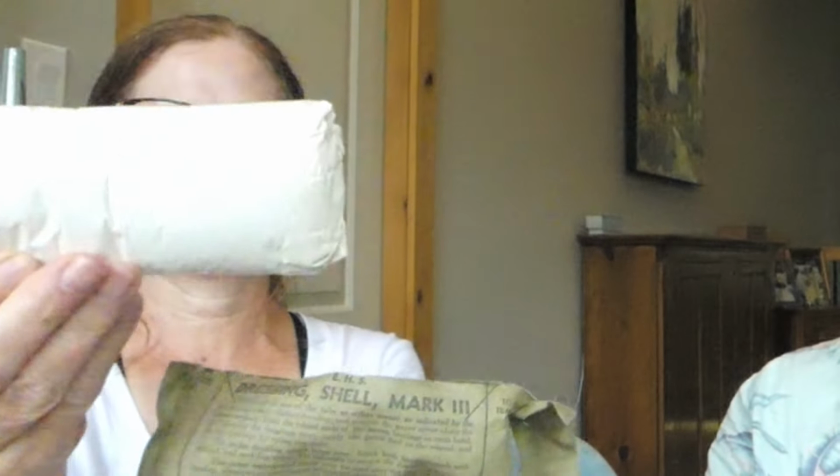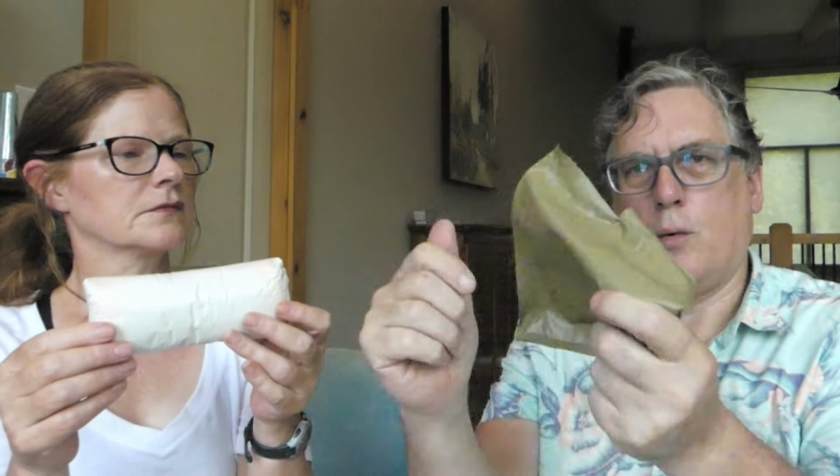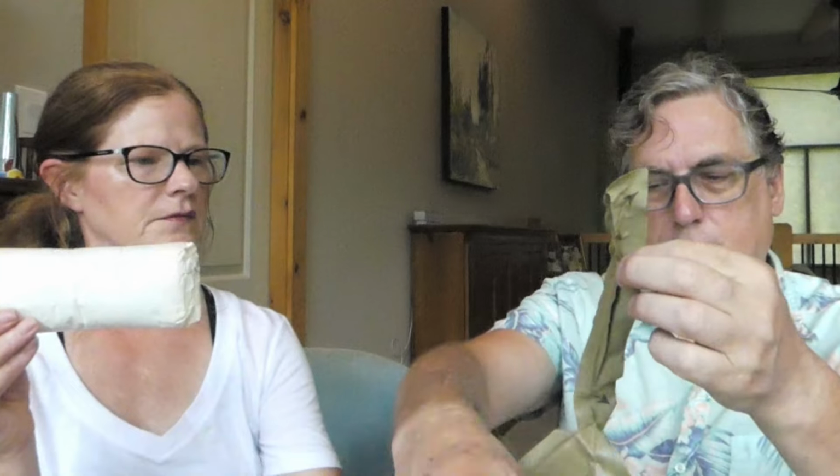we have a wrapped bandage. So this could be then ripped like this to provide a waterproof covering for that. You could even use that to tie it. Now there is no tape in this kit, which is a modern thing you would definitely get. You would definitely get tape in the kit. It says tie at the end, so I'm not sure how these are structured.